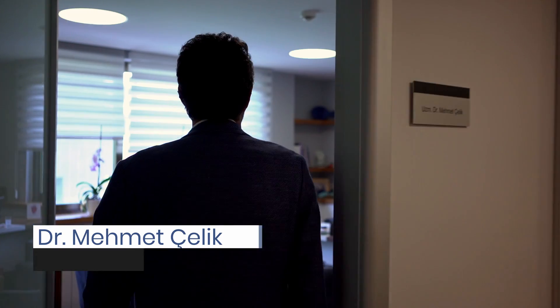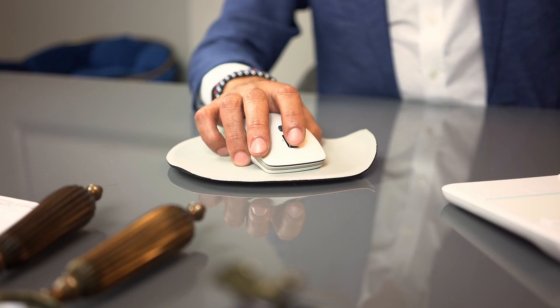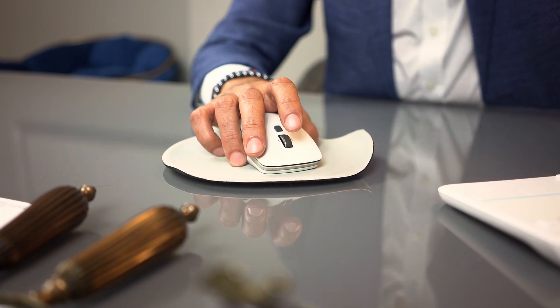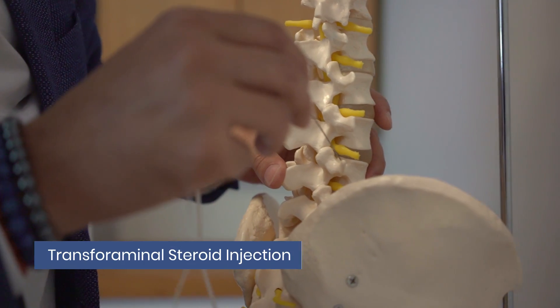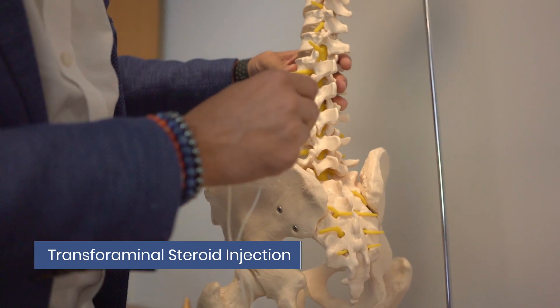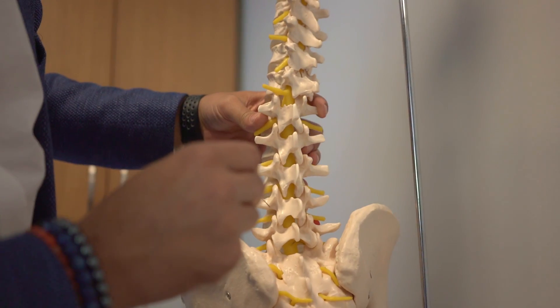Transforaminal steroid injection is one of the interventional pain management procedures which we perform frequently. It is useful for patients who suffer from neck pain radiating to the upper extremity due to herniated cervical disc, or who suffer back and low back pain radiating to the buttocks and legs due to herniated lumbar disc and moderate spinal stenosis.